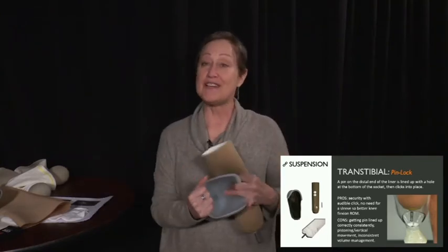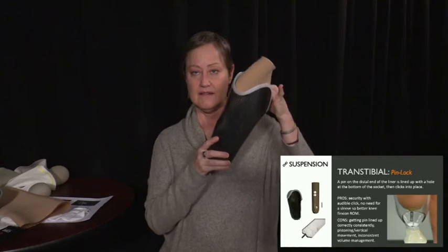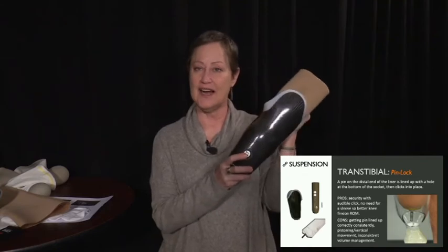So one of the benefits too is that then you don't have the sleeve and it's not so bulky. So here's what it should sound like. So you get a ratcheting sound as the pin goes into the lock. Now, here's one of the cons.